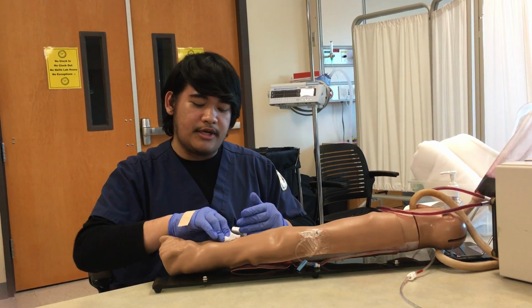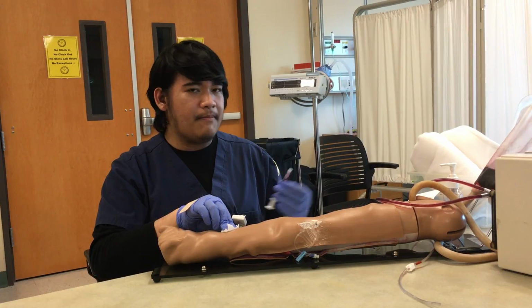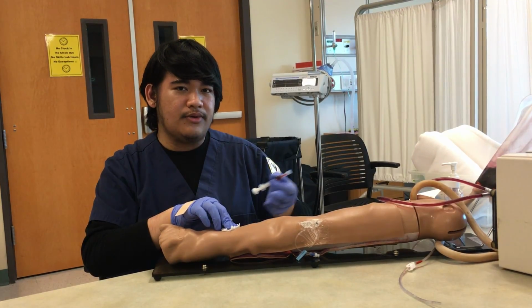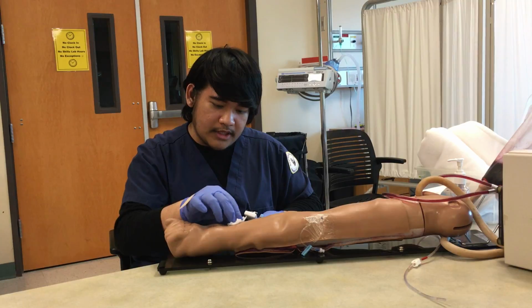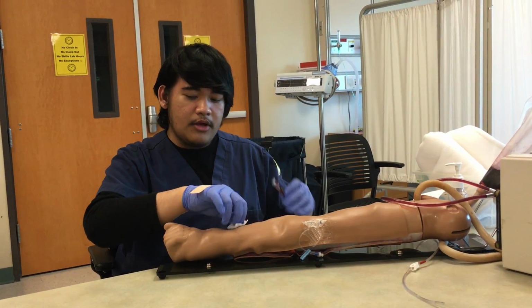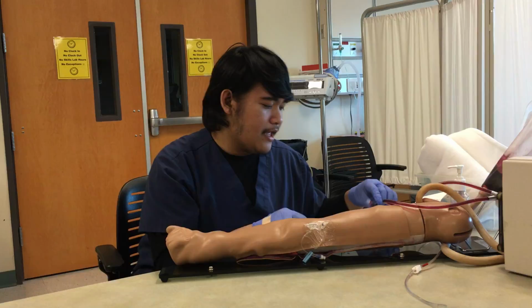It usually goes for about 5 minutes, but if the patient is on anticoagulant therapy, it goes to almost 10 minutes. Once you can't see any more blood coming out, once it's all dried out, we could put the bandage on it.